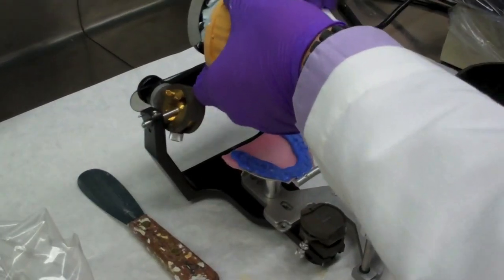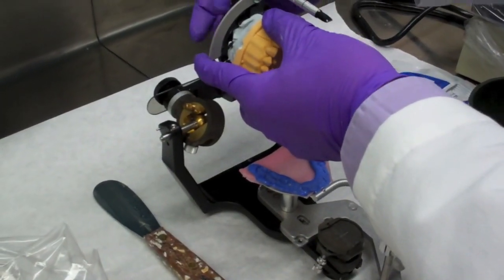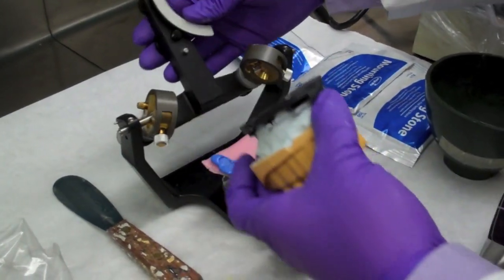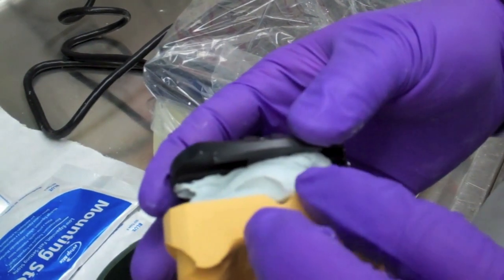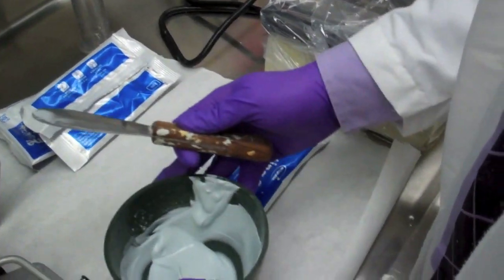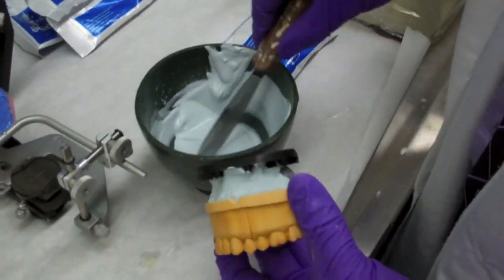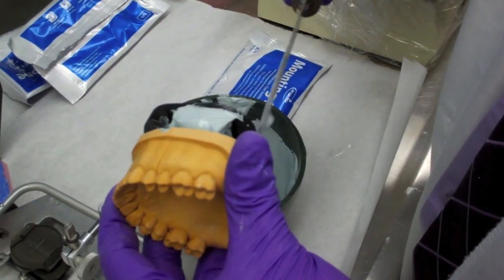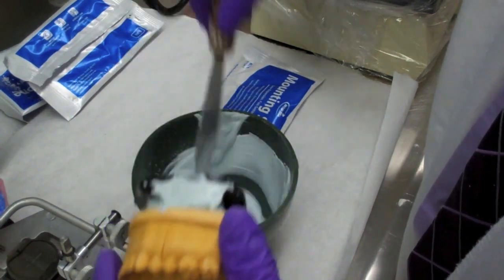We now must fill the voids left from the first step. We disconnect the maxillary from the articulator. Repeating the last steps, we mix another batch of stone. We then take the stone and fill in the voids between the plate and the model.